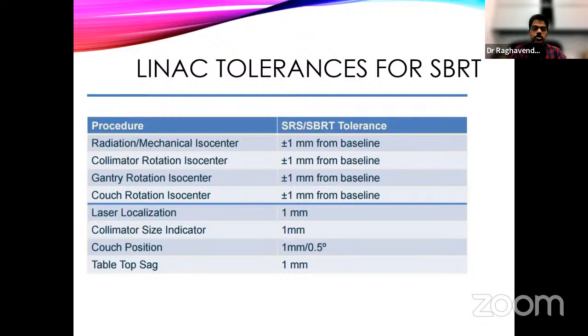you may have a linear accelerator which you purchased 2 or 3 years back, and at that time you didn't look for an SRS SRT program in your center, but a neurosurgeon joins and says, I want to start it, or your radiation oncologist says, I want to start it, then you will be in a dilemma whether the same LINAC can be tuned to give the accuracy required for SRS SRT. So nothing to worry, there are guidelines.